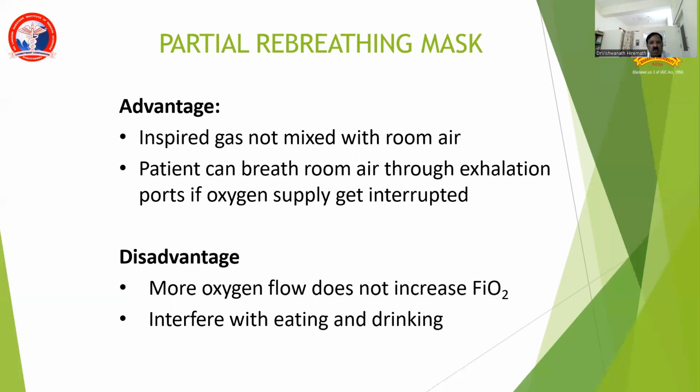Advantages of the partial rebreathing mask include inspired gas not mixed with the room air. Air dilution doesn't happen. But the patient can breathe room air through the exhalation ports if the oxygen supply gets interrupted. This is the advantage.